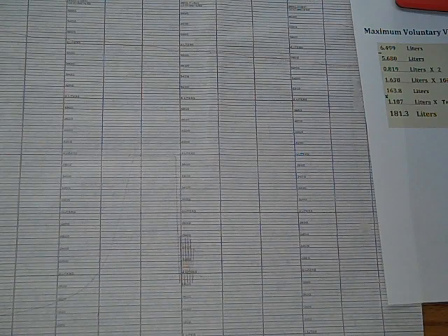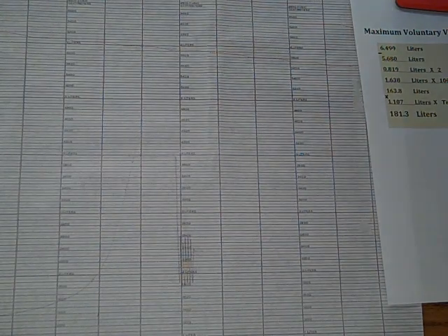So this would be a complete pulmonary evaluation, using equipment that I think we can say is very accurate, and probably use this to even calibrate a lot of the materials we use today.